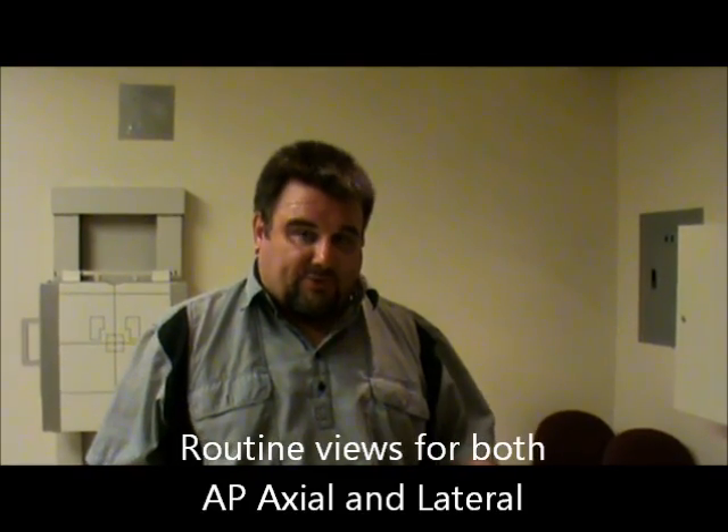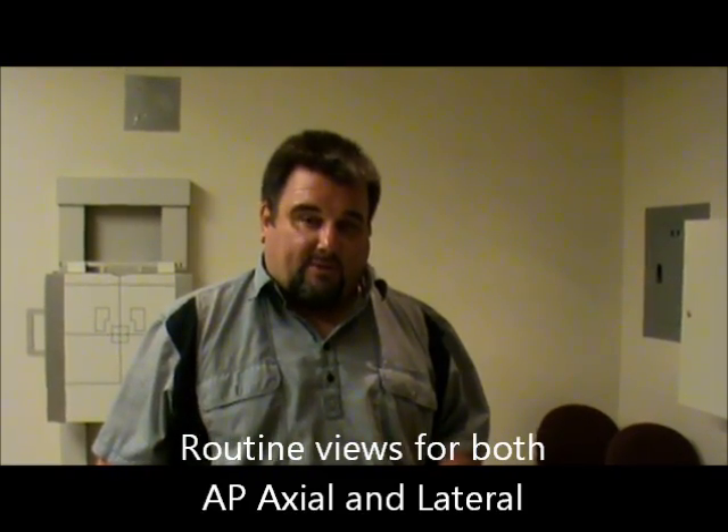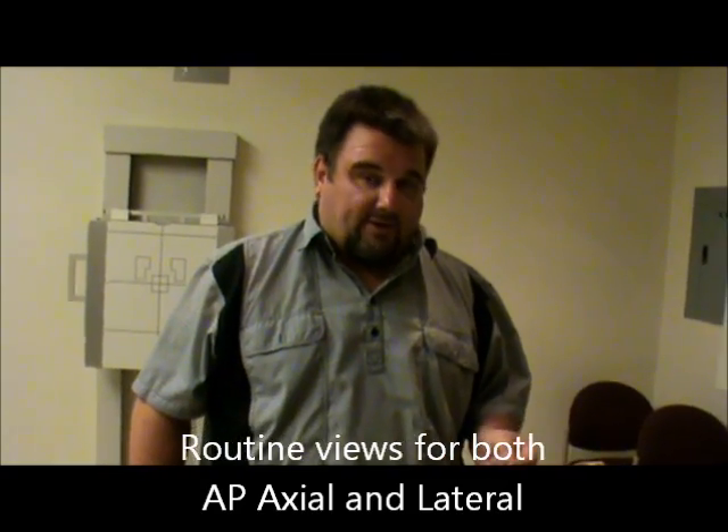Today we're going to be demonstrating the sacrum x-ray and also the coccyx x-rays. These are routinely done together. They are separate exams and the actual count is two comps, but we do them routinely together. When I demonstrate today, I'm going to demonstrate the sacrum, the AP axial view of it, and then I'm also going to demonstrate the coccyx, the AP coccyx, and then I'll demonstrate the laterals.